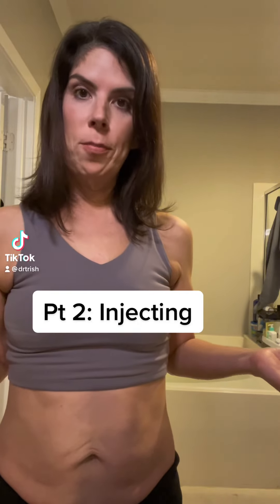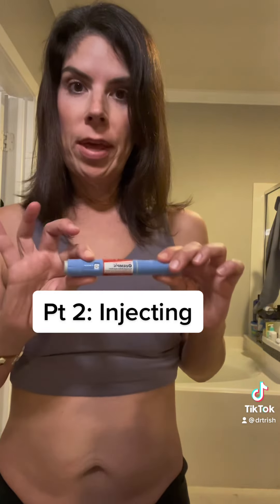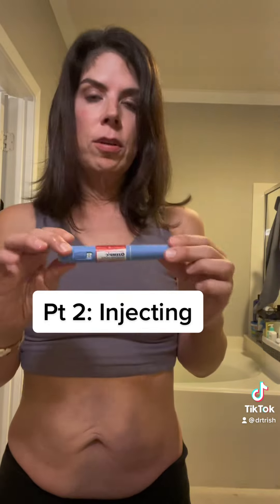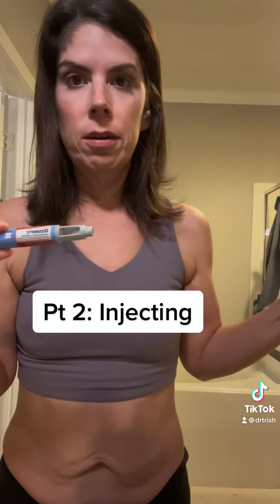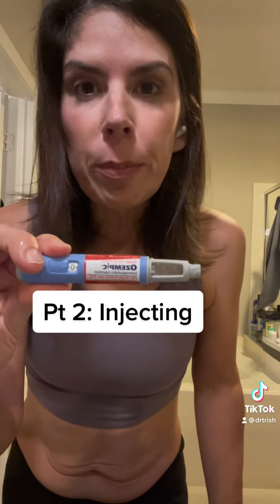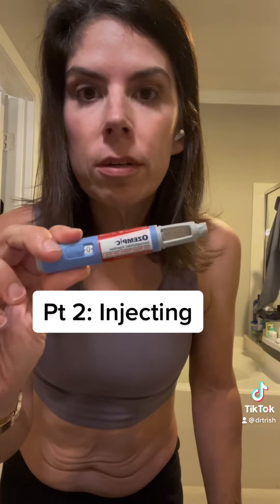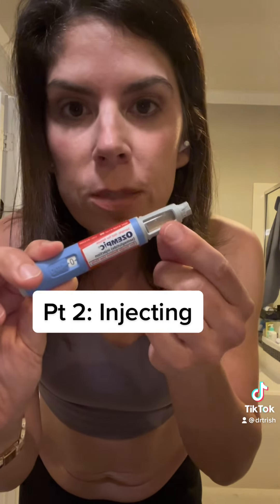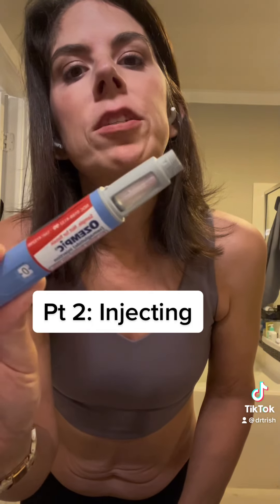The next step is to prepare my pen for injection. I have an Ozempic pen, so this one is not an auto-injector — you do have to push the pen button every week. Anytime you have a pen of medicine, whether it's insulin, Ozempic, Trulicity, or Mounjaro, always inspect the medicine and see if it's cloudy or if it's changed.